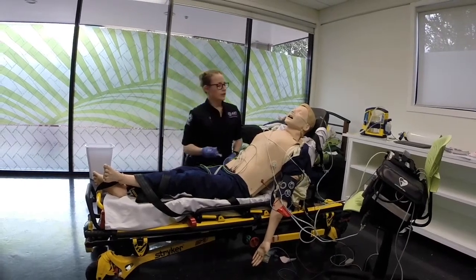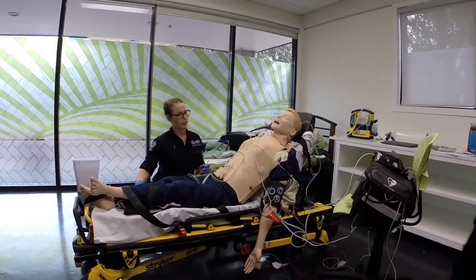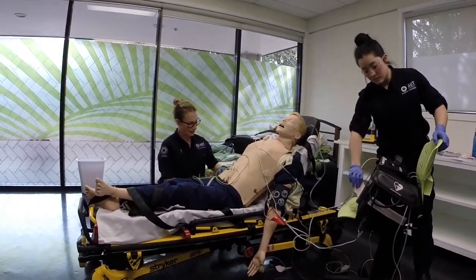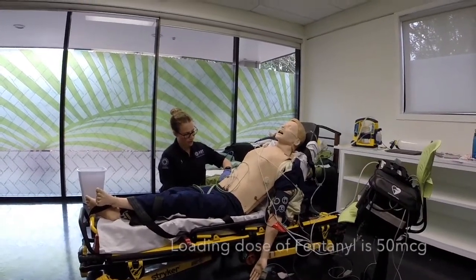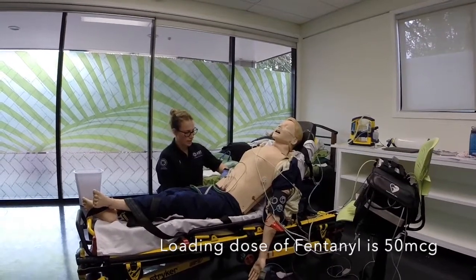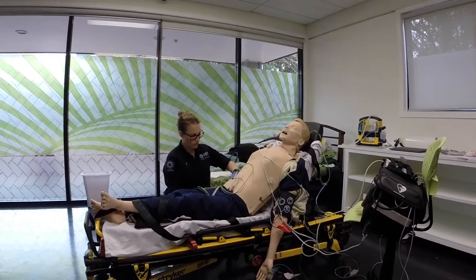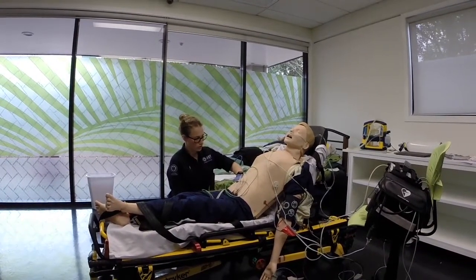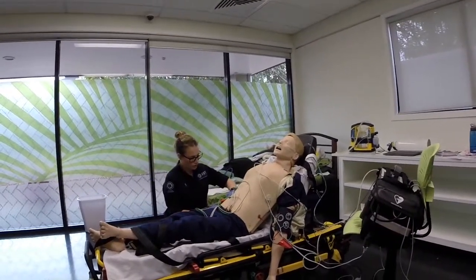So Bob, you're not allergic to fentanyl? No. Okay, so what I'm going to do is give you some pain relief, and you're probably going to want some, aren't you? Yeah, I'm really sore. Okay, so I'll start off first with 30 micrograms, and then we'll see how he reacts to that. Cool, so that was 30, and then a flush.